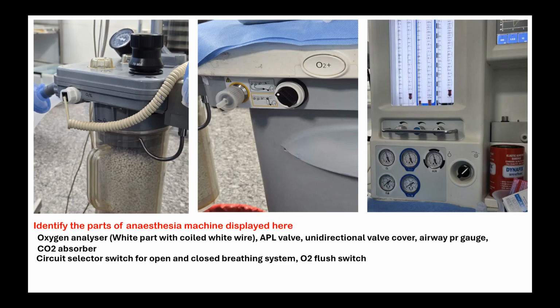Is this gas being used, or is it in the off position? Gas is being used. O2 and air. So you can see the float is not on the bottom. Here it is zero, whereas this one is in use now. Is it being used at high flow or low flow? High flow, because it is in the second tube.